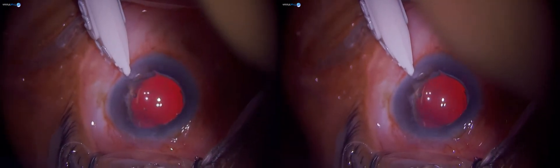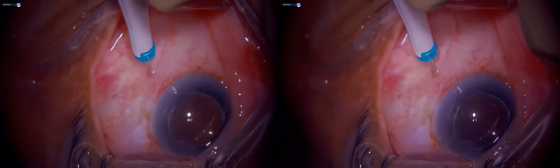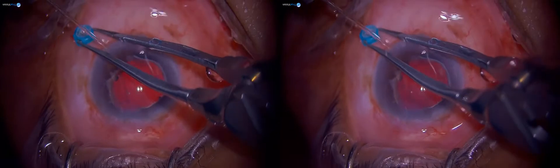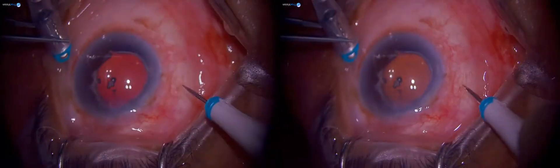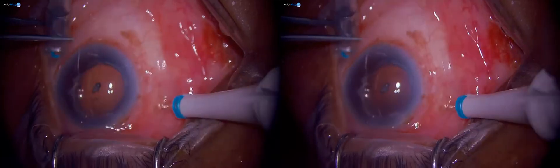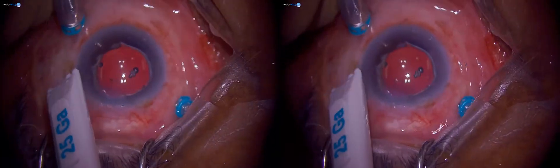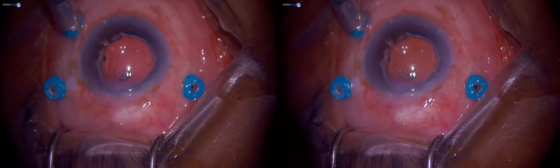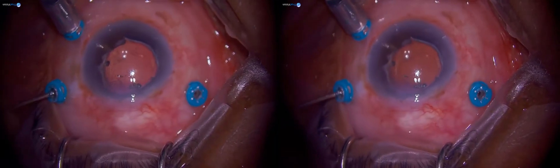We'll start the case by placing the three cannulas. How do you gauge where to put your ports from the limbus? It's based on lens status of the patient. The previous case was a phakic patient and we measured four millimeters. This one is pseudophakic, so we do about 3.5 mm. The upper two ports are placed just above the horizontal meridian; the inferior one is about two to three clock hours below the horizontal meridian.